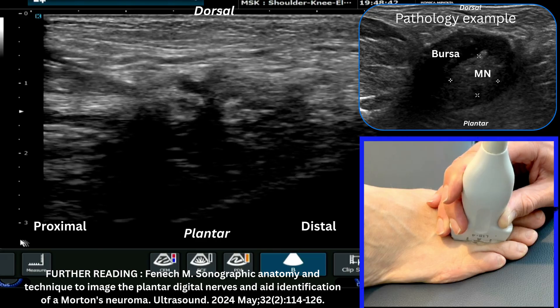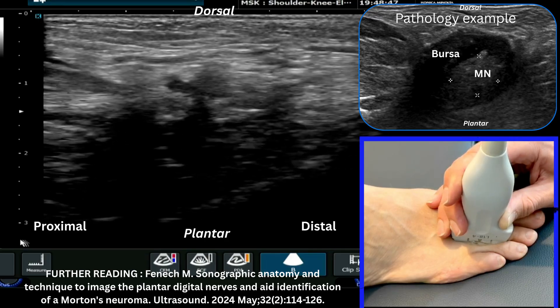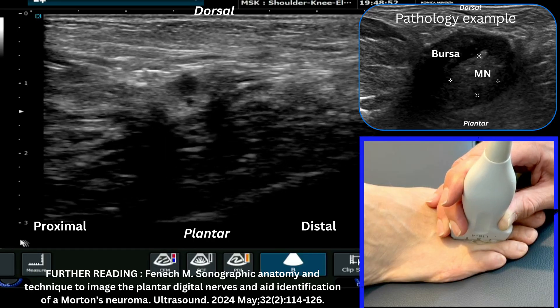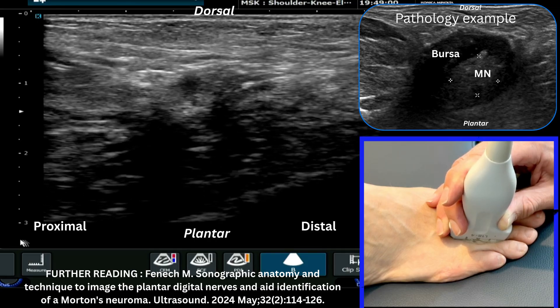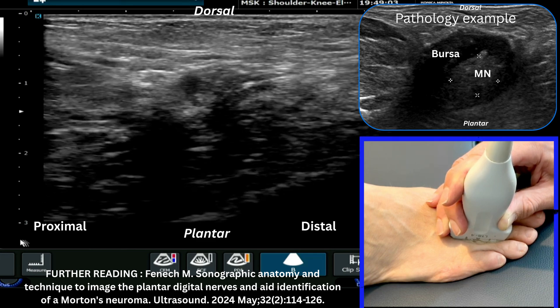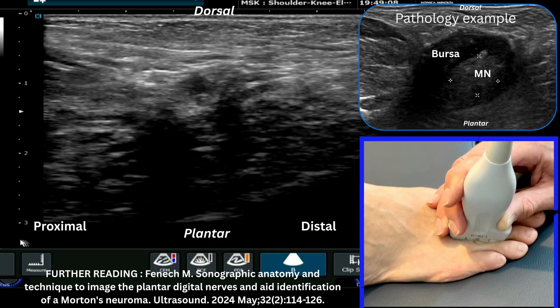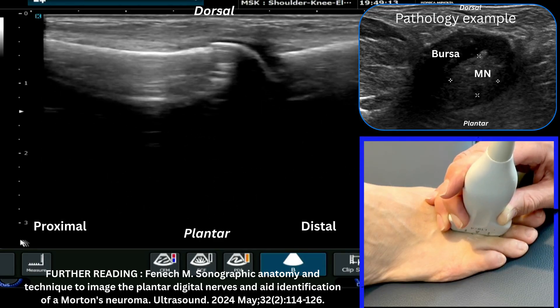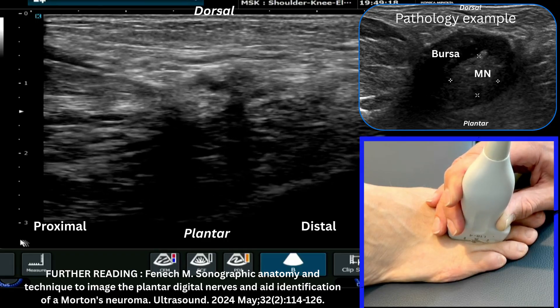The dorsal view is often more beneficial because you get less attenuation of your ultrasound beam — meaning it doesn't weaken as much when scanning this region. When you go through the plantar aspect of the foot, the ultrasound beam attenuates more and you struggle to get adequate penetration — we'll see that in the subsequent techniques. That is how you scan from the metatarsophalangeal joint across into the webspace from a dorsal perspective.